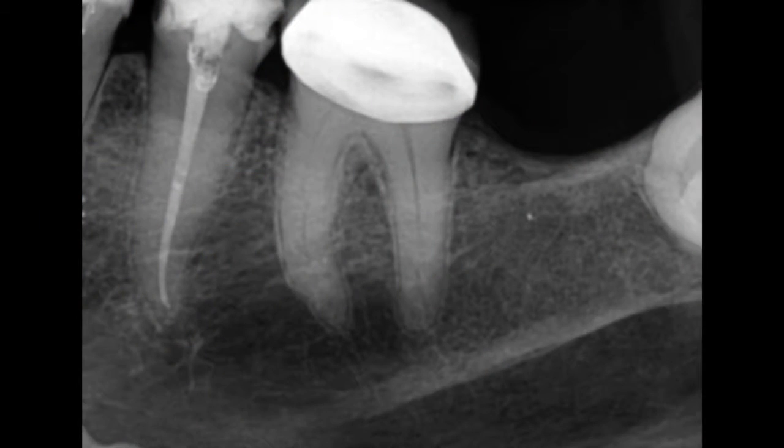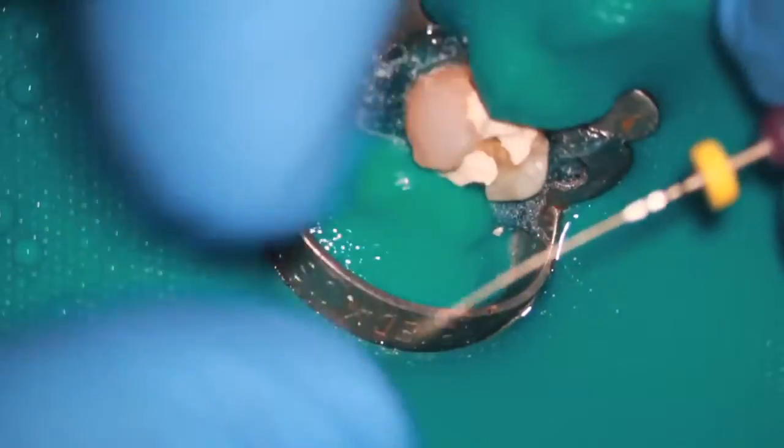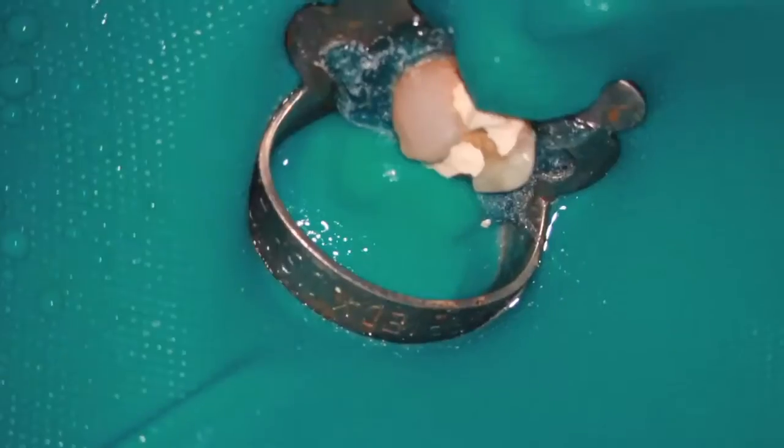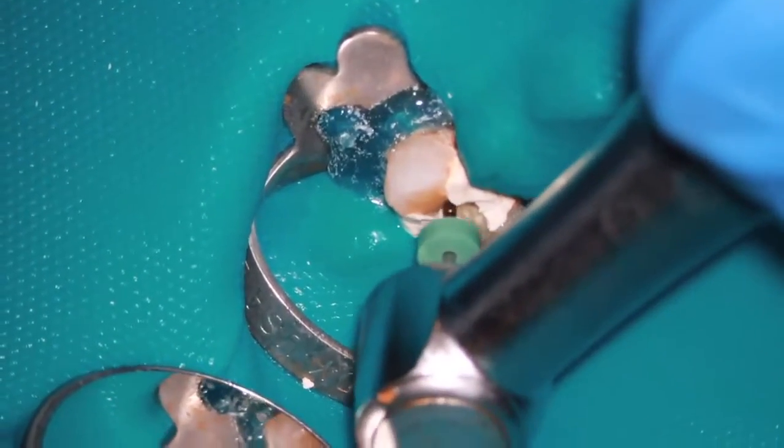Also, when you look at the obturation, you'll notice a little bit more dense fill in the apical segment with the gutta percha. The gutta percha is actually bending away from us. I felt this in my initial instrument. In my scouting instrument initially, it came out curved. It's bending towards the lingual aspect of this system. When I went down there with my initial instrument, rather than feeling my apex just in a straight way with a slight curve, it required me to put a bigger bend on it to negotiate that natural anatomy. The TRUShape instrument was able to maintain this, as you noticed.